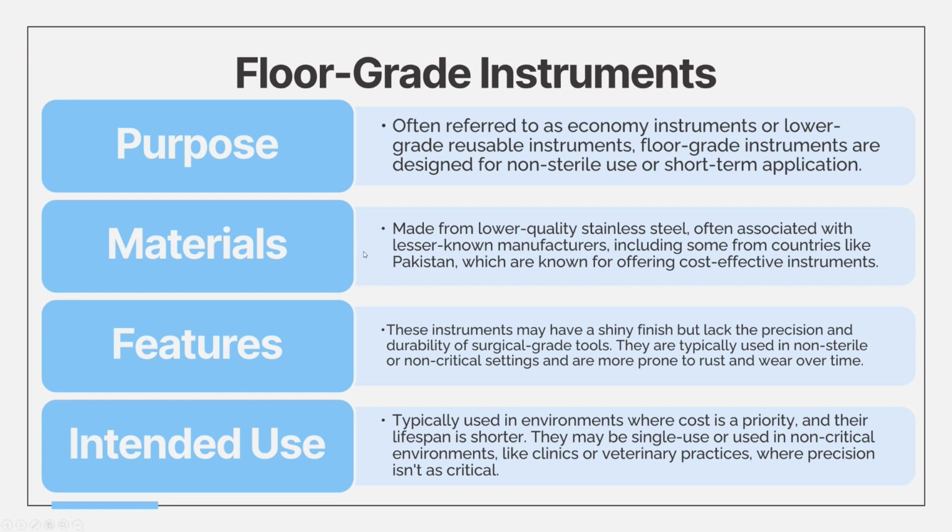They are made from lower quality stainless steel, often from lesser known manufacturers. So, a lot of these manufacturers that send these low quality stainless steel are actually from Pakistan because they are known to send us stainless steel of these grades in a cheaper manner.